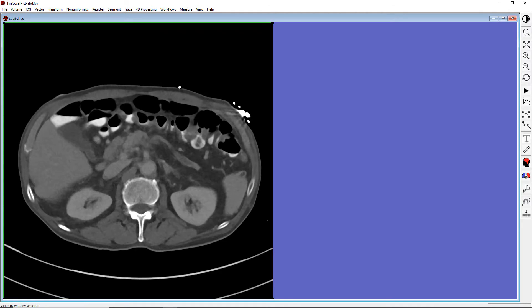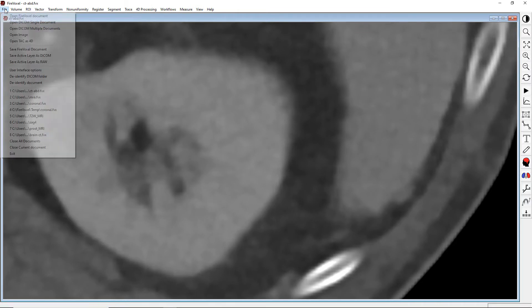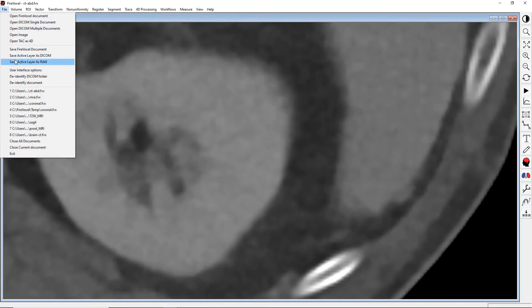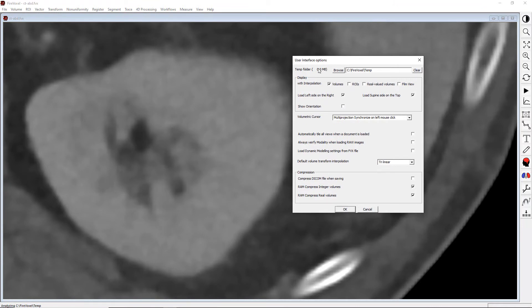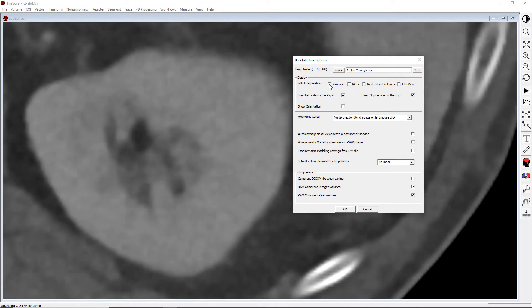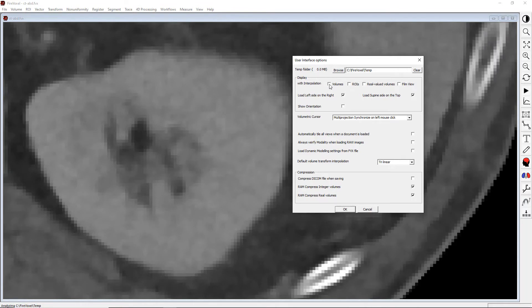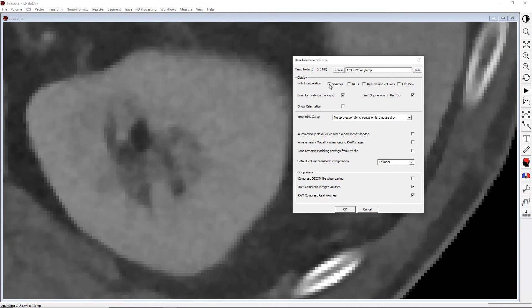Note that by default, images are displayed with interpolation. To change the interpolation options, go to File, User Interface Options, Display with Interpolation. If you uncheck the box for Volumes, your images will be shown without interpolation and will appear more pixelated.